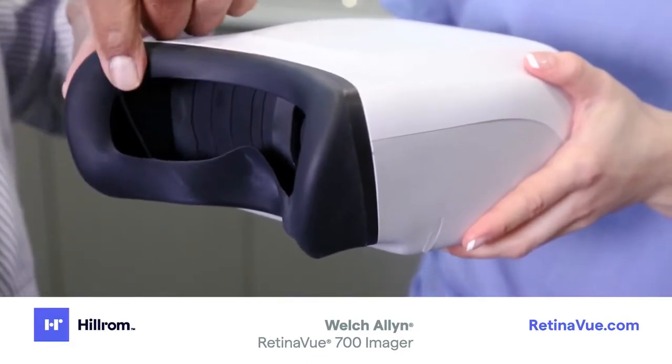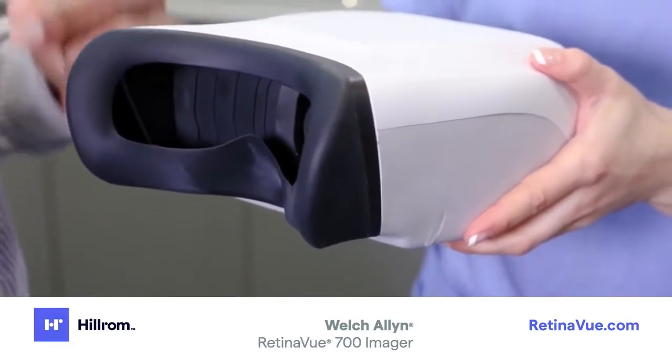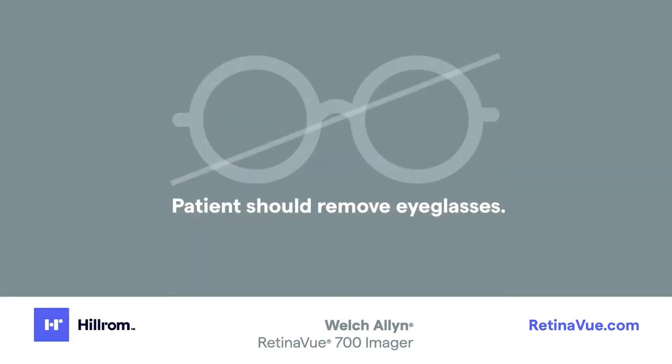The face cup is soft and flexible for maximum patient comfort. Patients should remove eyeglasses; however, contacts may remain in place.